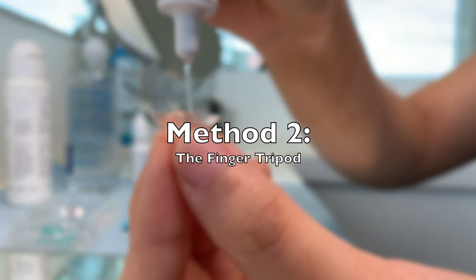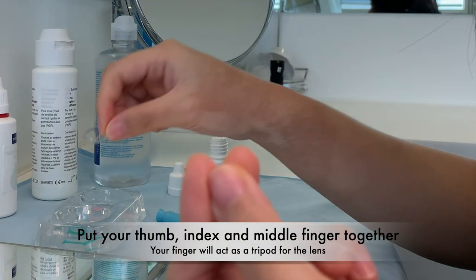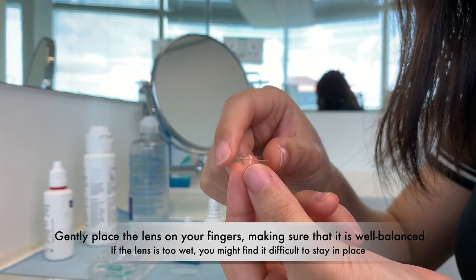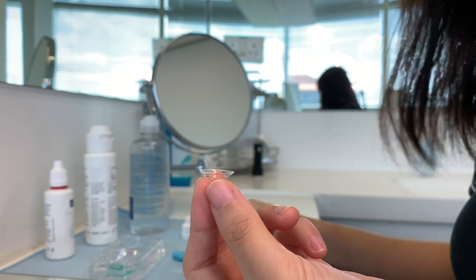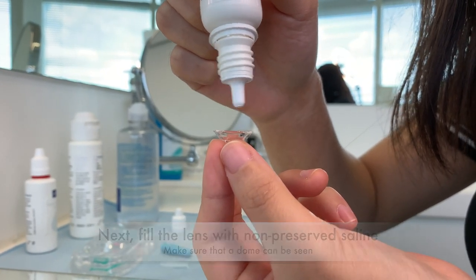The second method is called the finger tripod. Put your thumb, index and middle finger together as shown — your fingers will be acting as the holder for the lens. Gently place the lens on your fingers, making sure that it is well balanced. If the lens is too wet, it might be difficult to stay in place. Next, fill the lens with non-preserved saline, making sure that a dome can be seen.